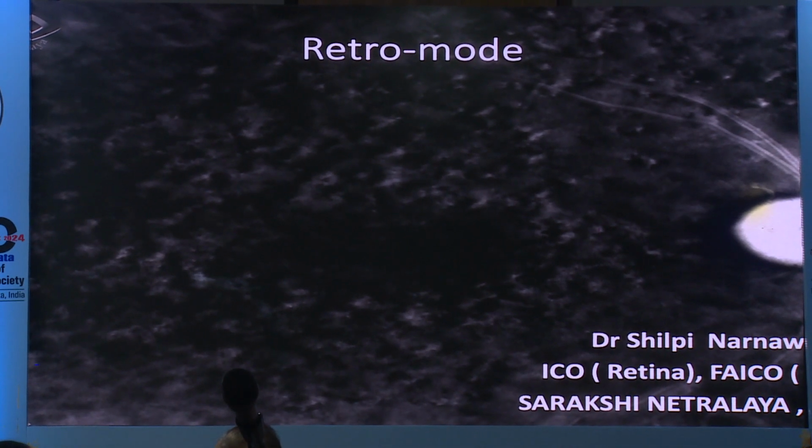Great presentation, Cheriyan. Especially when you pointed out the small pupil. We get so many situations where children walk into the clinic, very uncooperative with indirect ophthalmoscopy, and you put them on and take a picture, and in these cases, even if you go to the IR image, don't even go for the color image, with the IR image there's no light coming out, and you're able to document the entire fundus. So it's extremely useful in these cases. So is the patient who has a lot of photophobia, and post-operatively the eye is all congested and ballooned up, unable to see. In those instances also, as sir said, you get beautiful images.